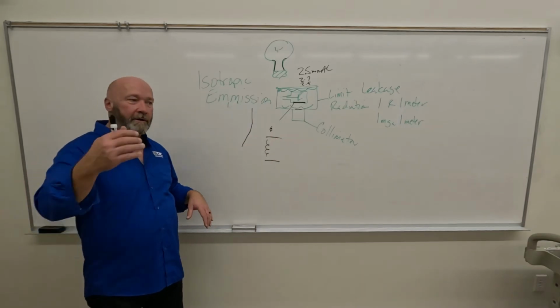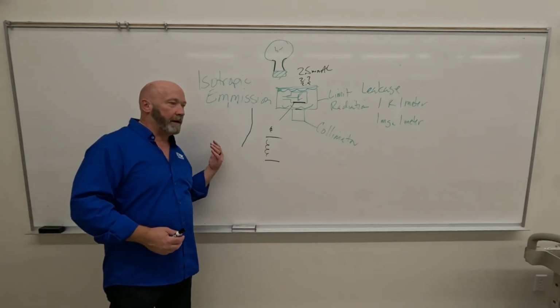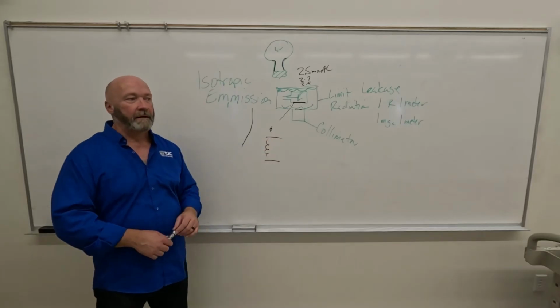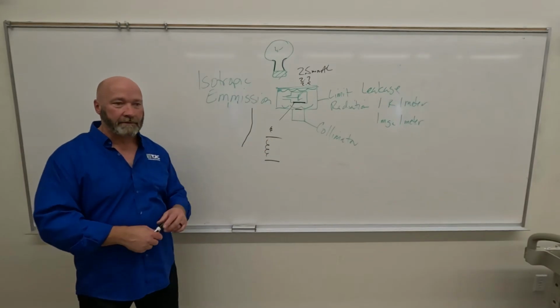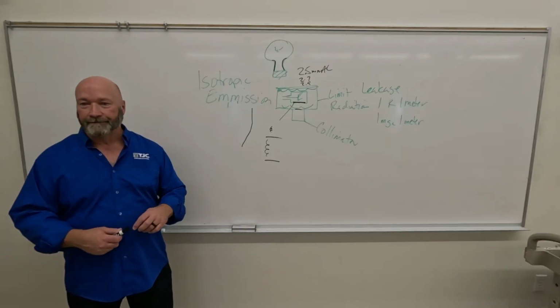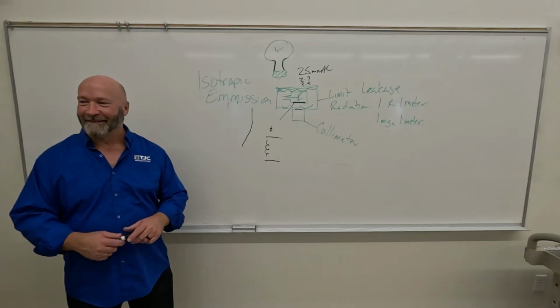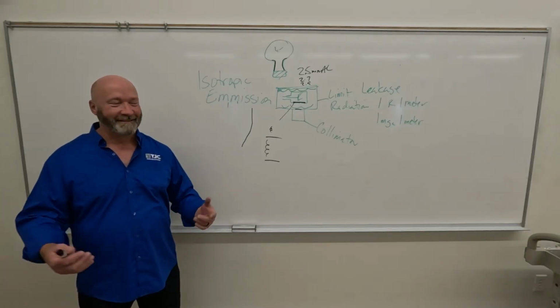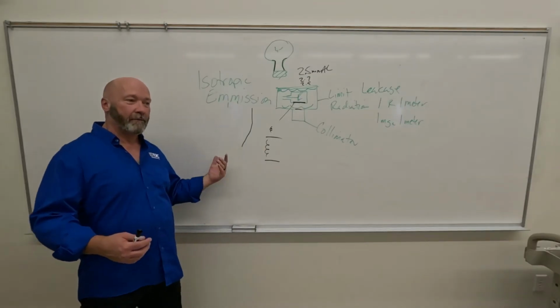But we can have a current high enough, or an exposure that's high enough, that even after we apply the voltage, we can't repopulate the filament enough. You're truly at tube limit. You can't send any more electrons. Any Trekkies in here? Star Trek fans? No? I think everybody's too young. I've given them all they got. That's all you can send. You can't repopulate it enough.